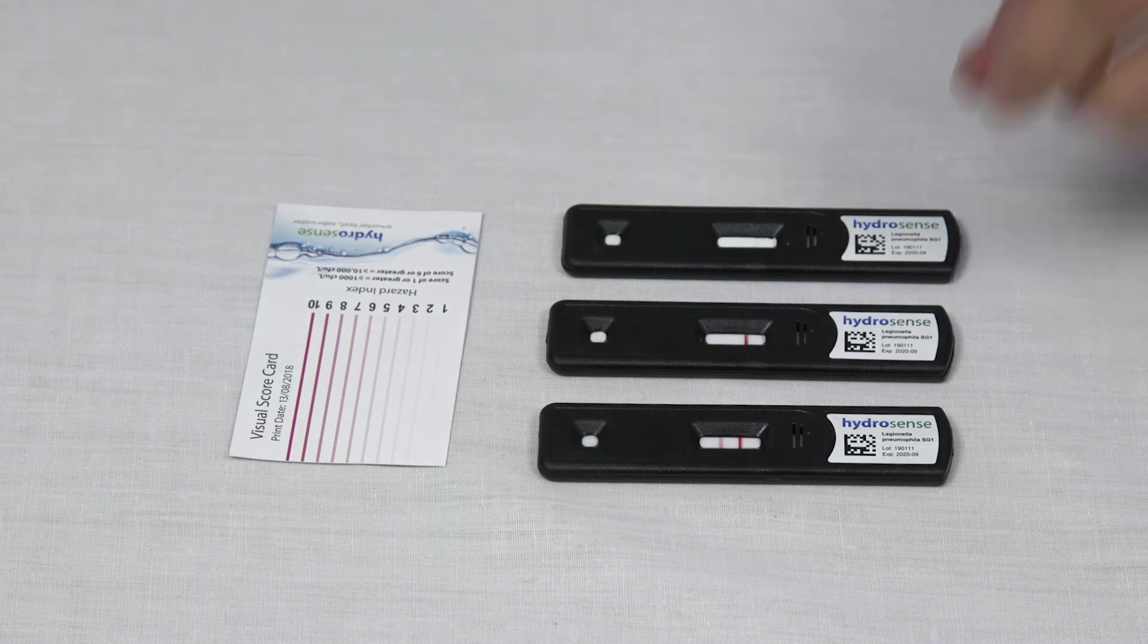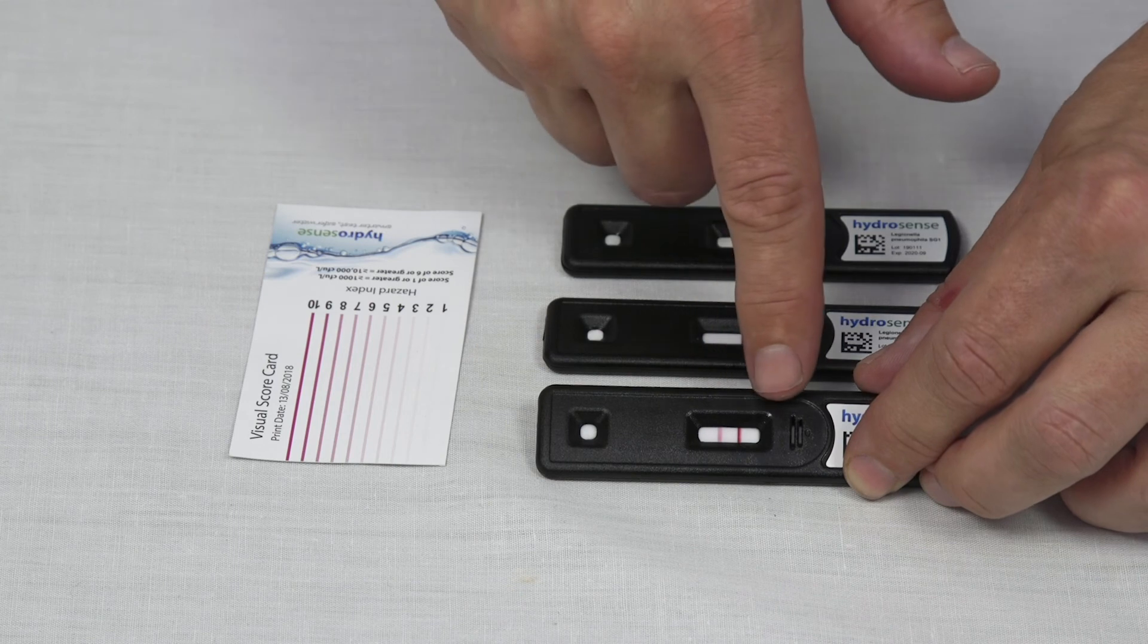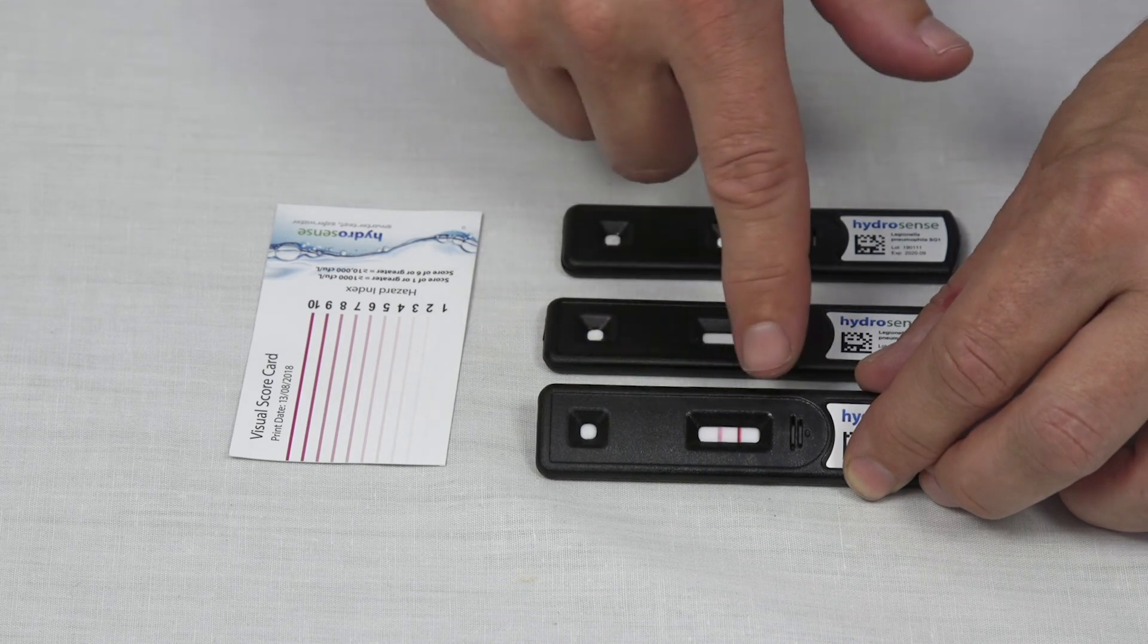The test consists of two lines: a test line and a control line. If both lines are present, then the test is positive.